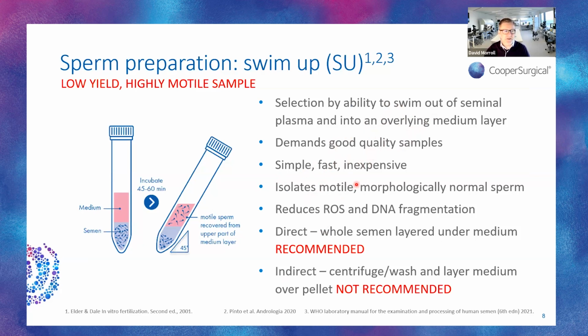It's an easy technique, with the caveat that it demands a certain amount of technical finesse, because poor technique allows some seminal plasma to be dragged up, and that can impact the quality of the sample that we get at the end. And a really nice paper from Lars Bjorndal and colleagues showed that if you use zinc as a proxy marker of contamination by seminal plasma, swim-up samples often have elevated levels of zinc, showing that seminal plasma is dragged up or taken up during the harvesting process. So we have to be mindful of that.